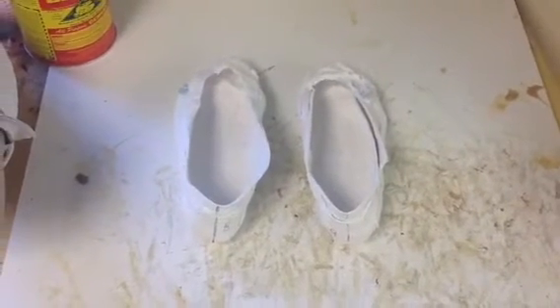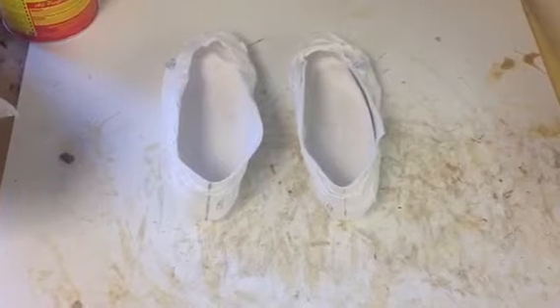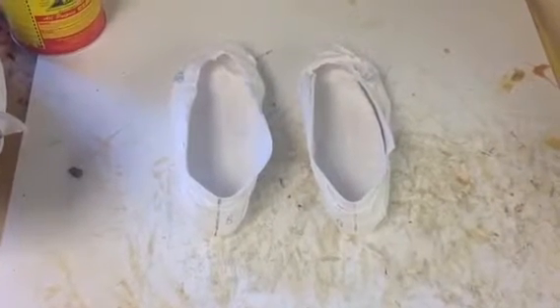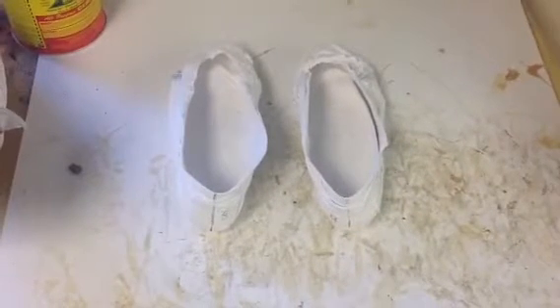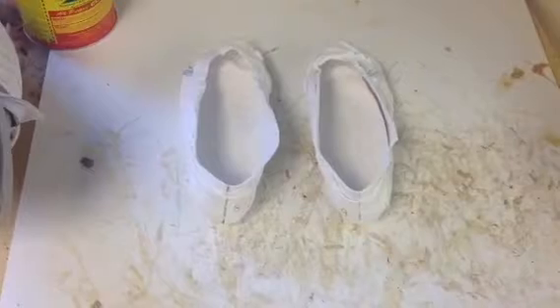Today I want to talk about treatment of the forefoot varus foot. Forefoot varus is where the front of the foot is tilted up, where the big toe, or first metatarsal, is higher than the fifth metatarsal.